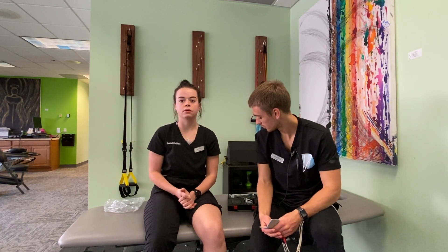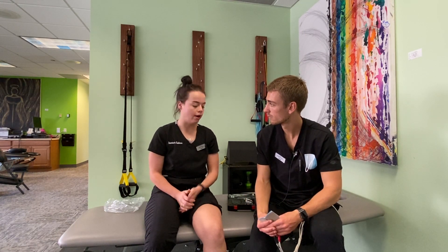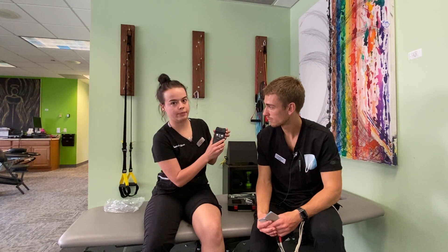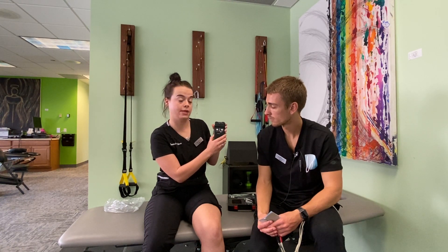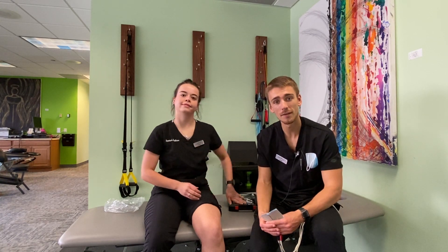You can do e-STIM as much as you want anytime you're feeling pain. On the e-STIM unit itself, if you open up the slidey part, there's a timer on the bottom — it's currently set to 30 minutes, but you could also set it to 60 minutes. And that pretty much sums up our TENS unit, the electrical stimulation machine.